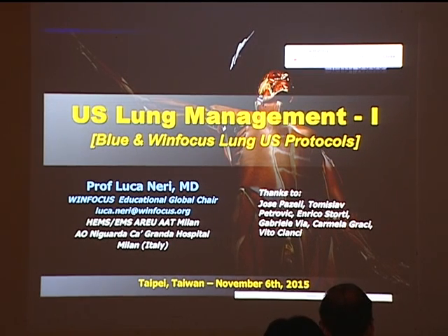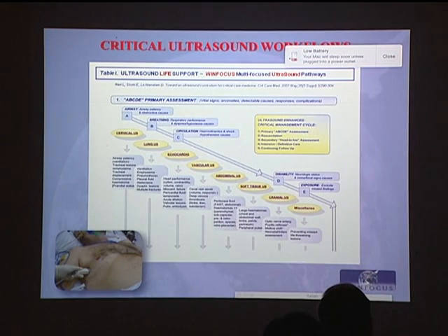Okay? We'll see this part systematically in this lecture. We will first summarize all the main findings. Then we'll try to compose the sonographic findings in different pathology syndromes, and then in different clinical scenarios. This will be given to you lecture by lecture, and you will have the final picture tomorrow. So let's try to be systematic on this application.